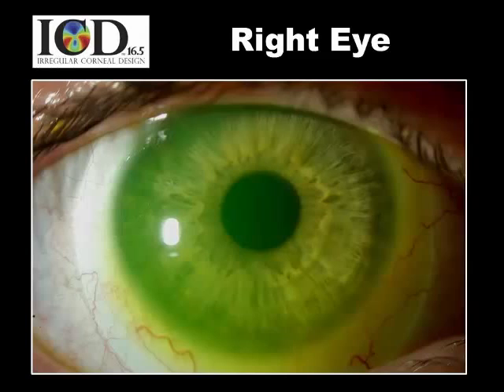And that's what we did. We put on the ICD to vault completely over the cornea, create this fluid layer, this ocular bath basically of fluid between lens and cornea, and make the surface much more wettable than it is.